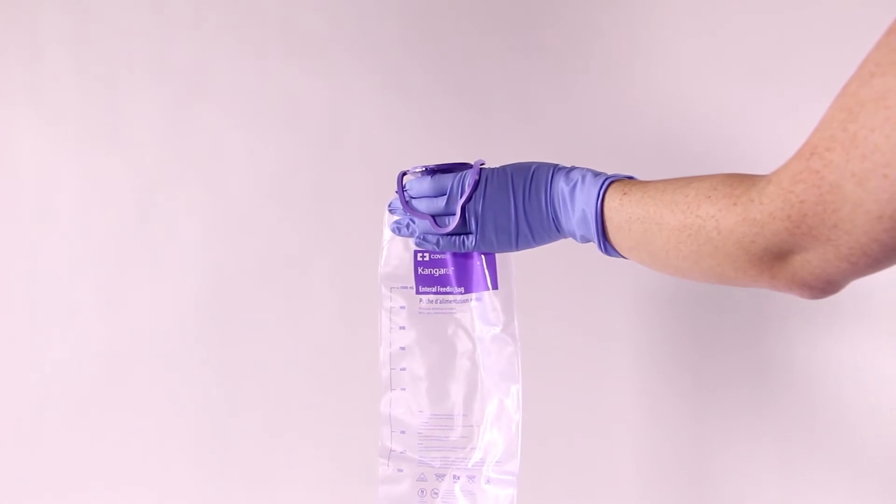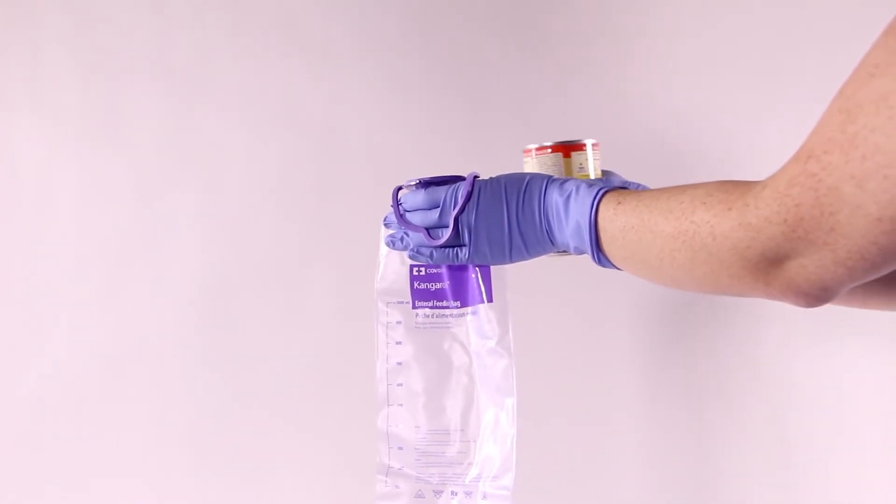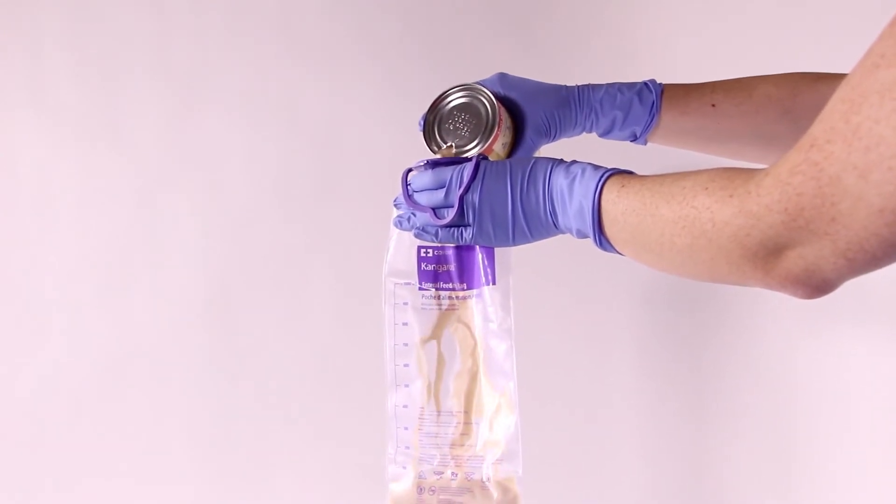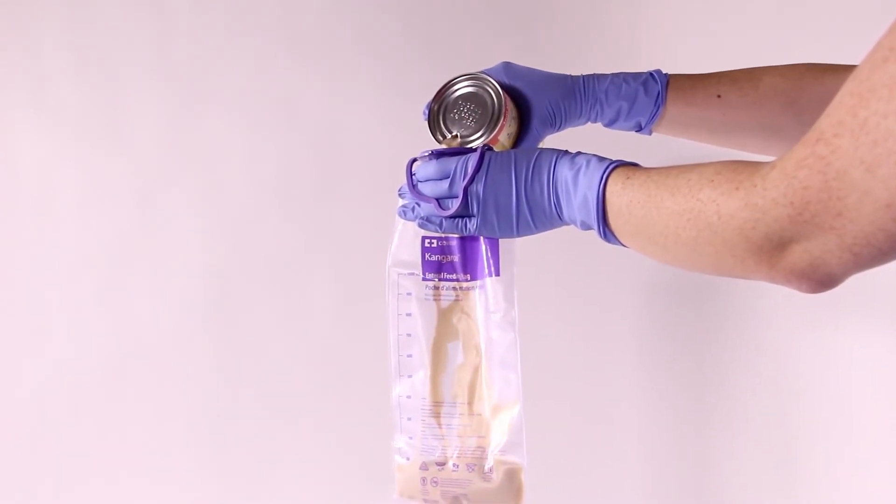The first step of basic pump operation is to prepare and load your feeding set. To prepare your feeding set, simply fill the feeding bag or spike the feeding container per your standard procedure.